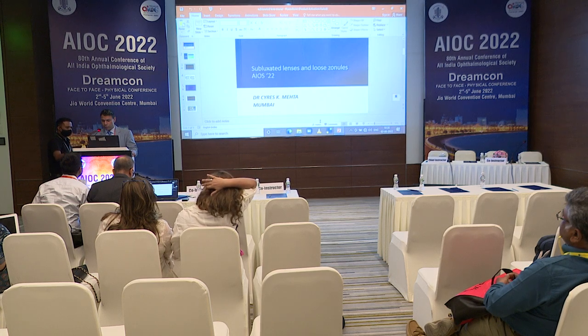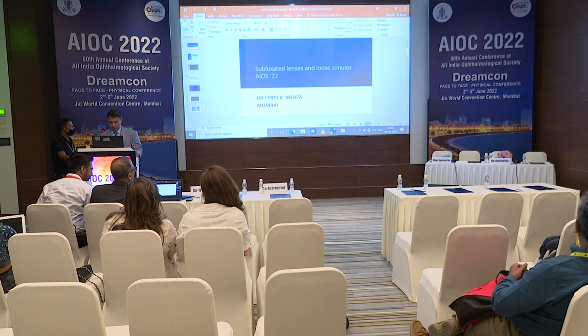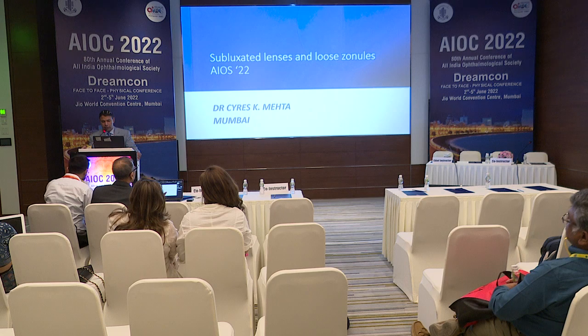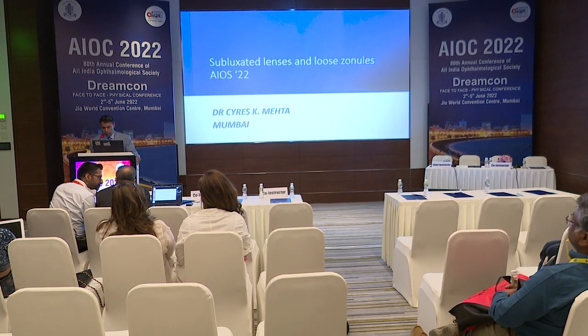So I've got some 4-5 videos. What we'll do is that we'll skip to the important ones and lose the others. All right. So I've been giving the subluxated lenses and loose zonules kind of course at ESCRS for many years now.